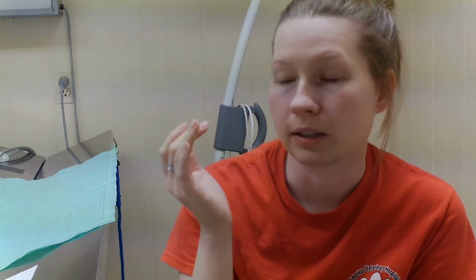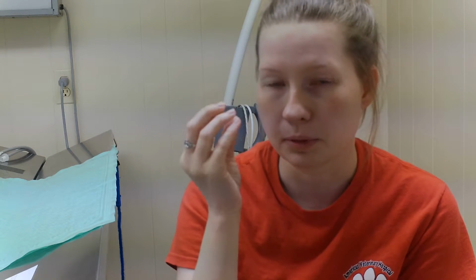What else? We have the palpebral or wink reflex. That is real easy to do. You've seen me do it in a couple of my videos, where you press on the medial or even the lateral canthus. I usually use the medial canthus of the eye, and my eye will do it too. You can do it to yourself, and it's just a reflex. You cannot help it. Patients anesthetized in any lighter plane of anesthesia will do it. Just tap on the eye and it'll blink or wink a little bit, and that's a really good indicator. That's probably the more commonly used one for anesthetic depth.